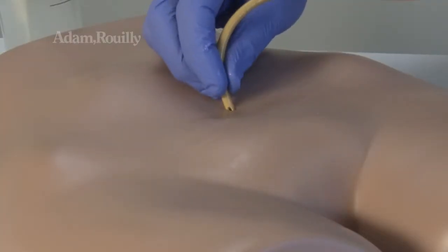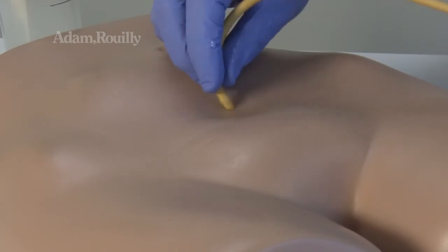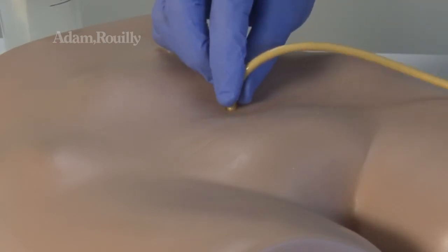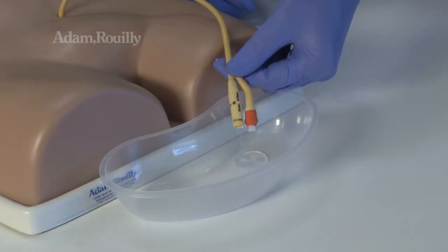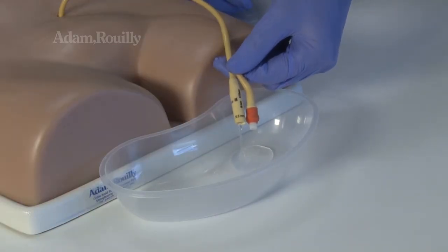During use, a suprapubic catheter may be inserted. Successful catheterization is confirmed by water flow.